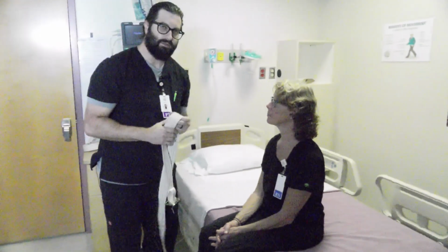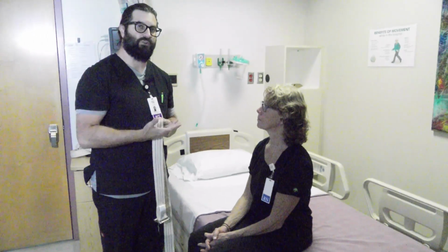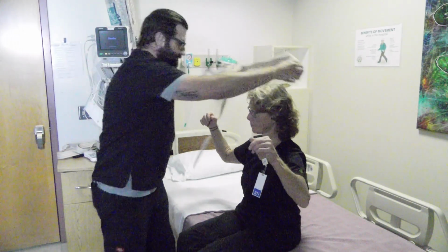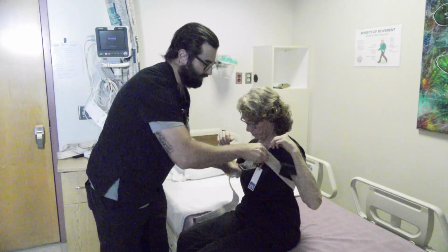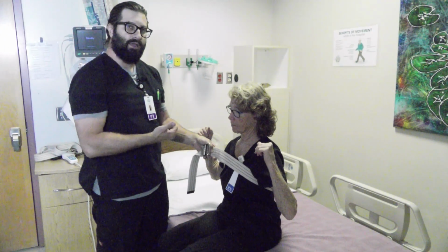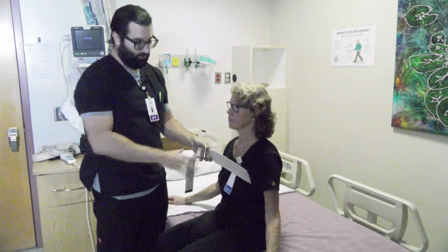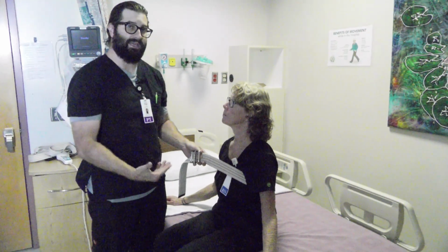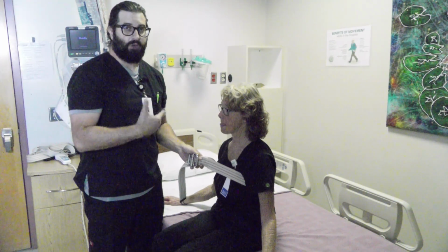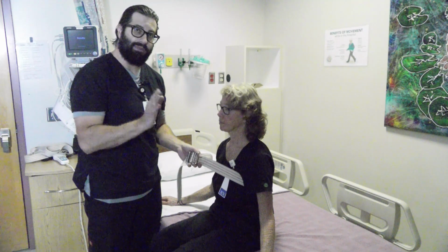Now, what I see a lot done in the nursing world is that the gait belt is put on too high for the individual, so they come around under the shoulders. So if I were to do that, and I would ask Miss Patty to lift her arms up, what I see quite frequently done is that the gait belt is put up here, and so if you can imagine when I go to lift her, basically what I'm helping assist is just her shoulders and her neck and head. And the rest of her body, I don't have good control or support of it. So you're going to have a harder time lifting the individual. Also remember, on a lot of elderly and frail folks, they already have shoulder problems, and so you can actually aggravate a shoulder condition, so you want to be very careful with that.